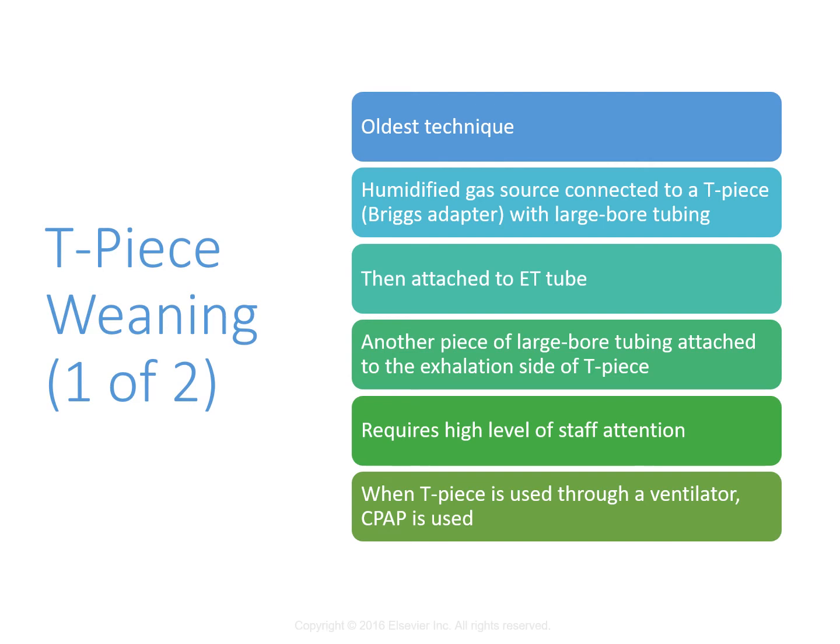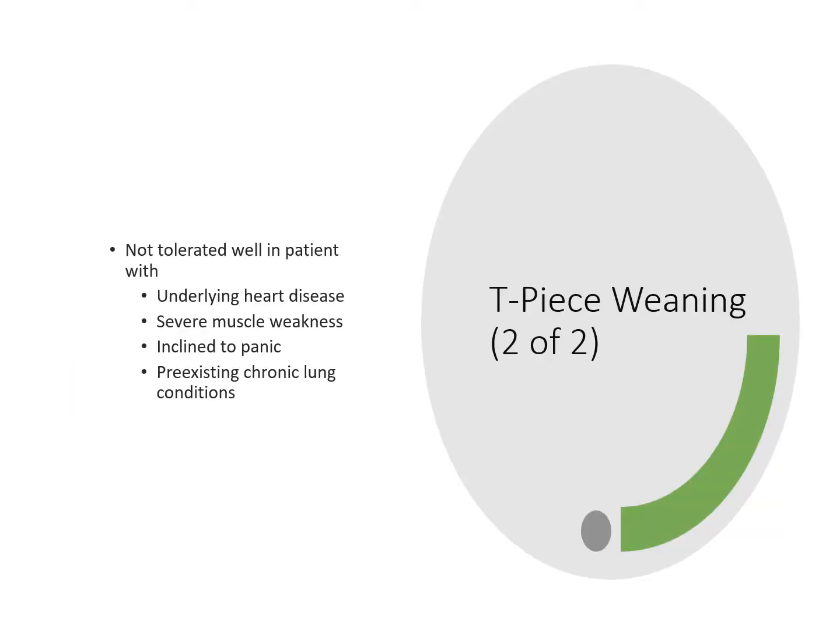So using a T-piece trial using the ventilator instead of just doing the heated aerosol thing really is a good advantage nowadays, right? They have more bias flow through the circuit. And then we have that apnea mode, we have the backups, we have all that stuff as support for that patient when or if they fail that wean.